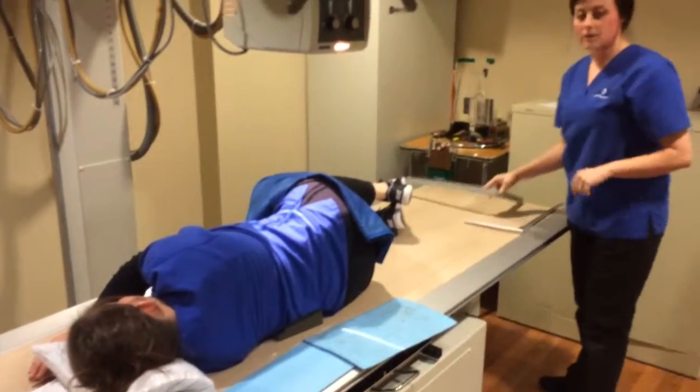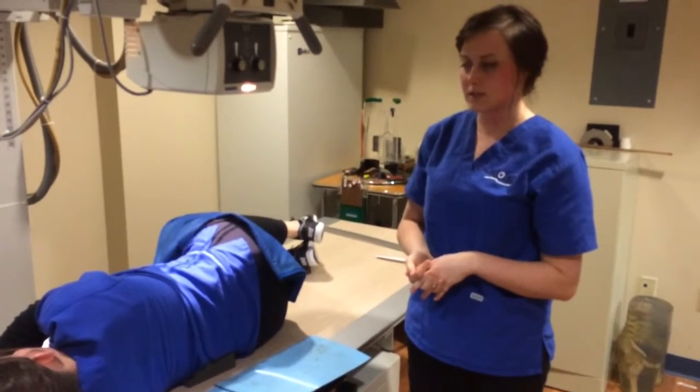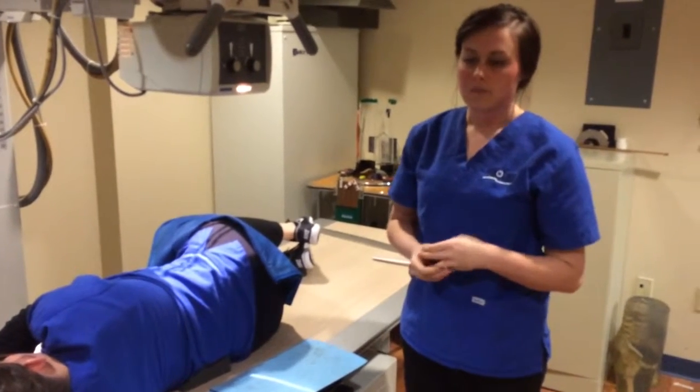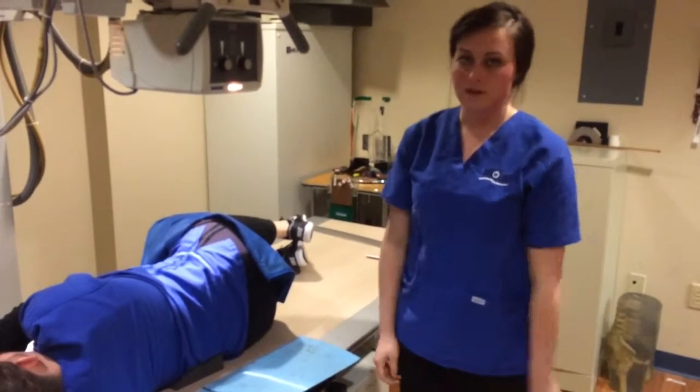And then again, I would go out and set my exposure factors and tell her breathing instructions, which are again to blow her breath all the way out and hold it out to bring the diaphragm above her lumbar spine.